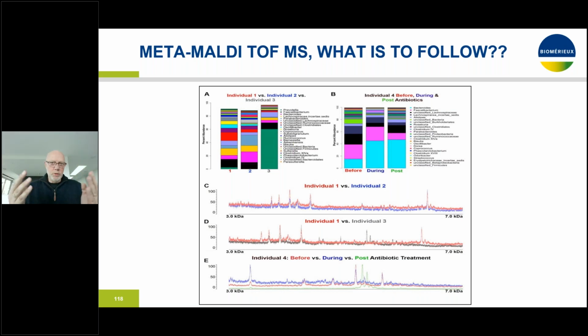If you're close to Clostridium difficile associated phenomena, then the richness of the flora may go down and the peak pattern will simplify. So in that way, you can distinguish between a healthy, complex flora state as measured by many peaks in your spectra, and if that simplifies and you only see a few peaks, then you know that there is dysbiosis, and that this person who provided the sample is either already ill or most likely to become ill very soon.